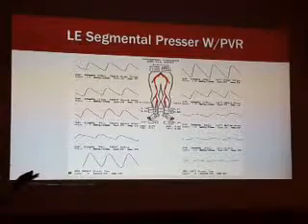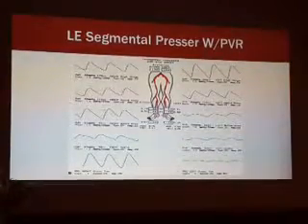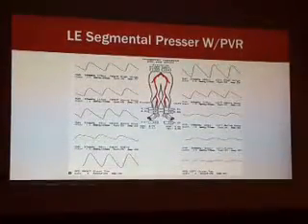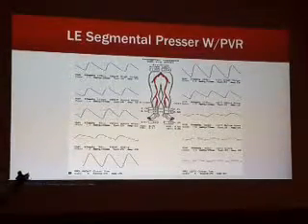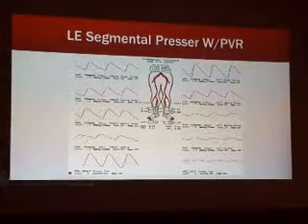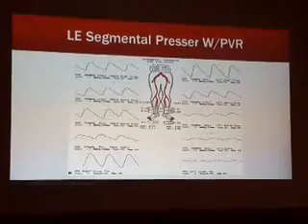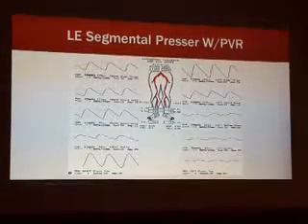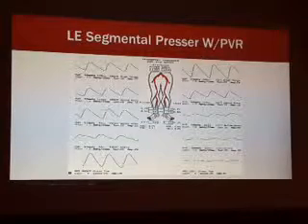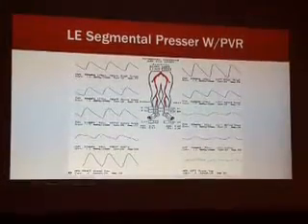So this gives you information to start your Doppler. Now you know what you are going to do. You are not just doing screening from up to down; that is a waste of time and resources for a Doppler. The ABI machine takes a 30-minute procedure. Once you finish it, you know exactly where you are going with your ultrasound. To say, I have category 4, ABI 0.7, and when I scan the tibial artery, I saw occlusion or stenosis up to 70%. This is your information. You're doing it very well, and you give them the exact answer they needed, and they will go directly to the angioplasty, to the exact area you pointed to by this map.